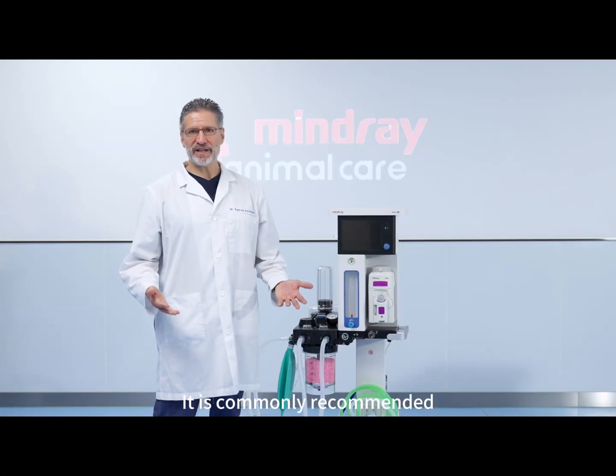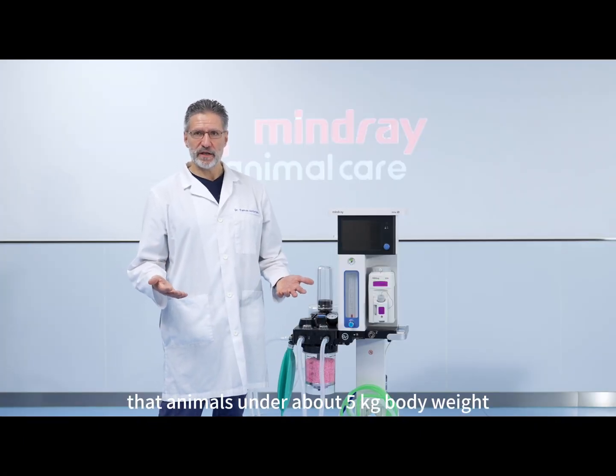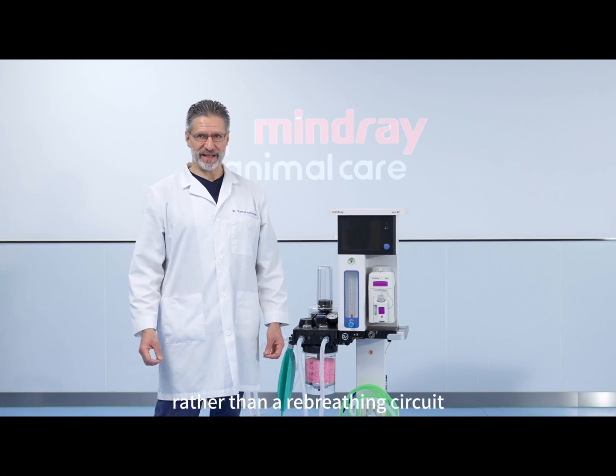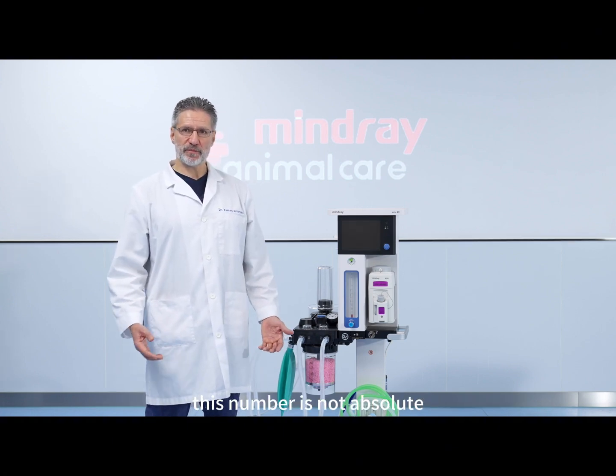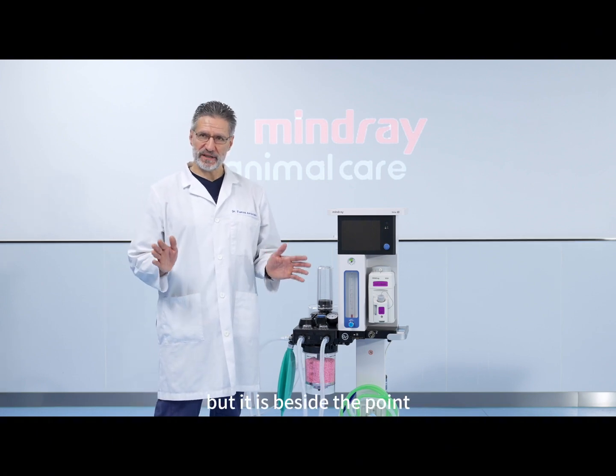It is commonly recommended that animals under about 5 kilograms body weight should be connected to a non-rebreathing system rather than a rebreathing circuit. This number is not absolute and you may very well choose a different number, but that is beside the point.